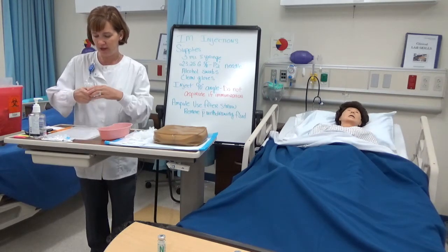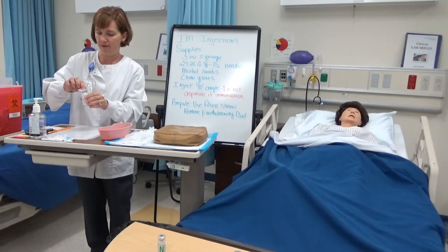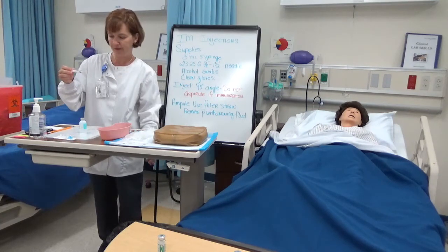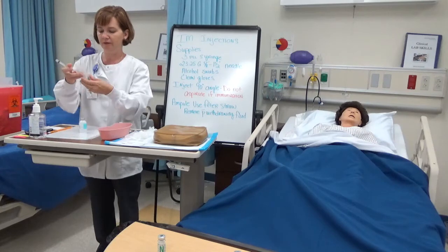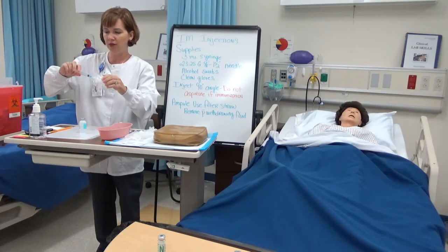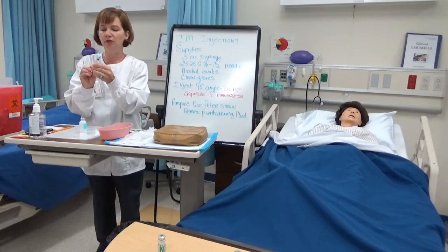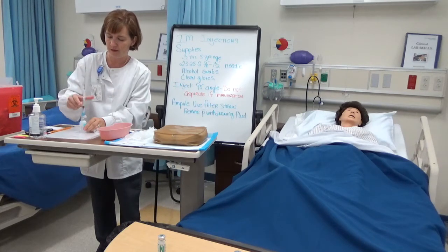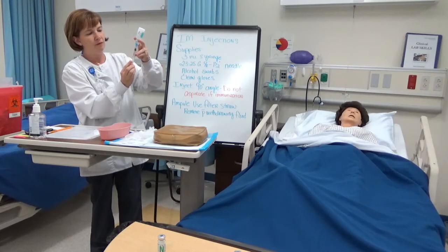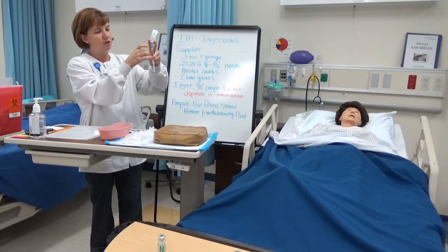I'm going to go ahead and draw that out of my vial. I'm going to use a 3 mL syringe — I have a garbage can here at my feet — remembering all the tips are sterile. For this IM I'm going to use a 23 gauge 1 inch needle. Since I'm pulling out 1.2 mL of fluid, I'm going to inject 1.2 mL of air. I'll go a little bit past the 1.2 mL and get rid of any air bubbles.